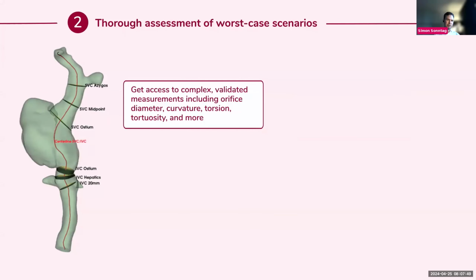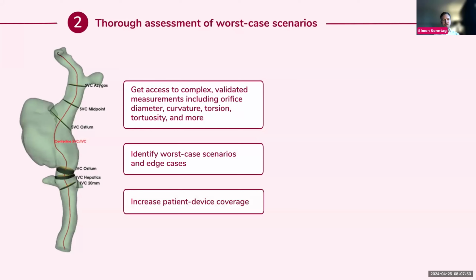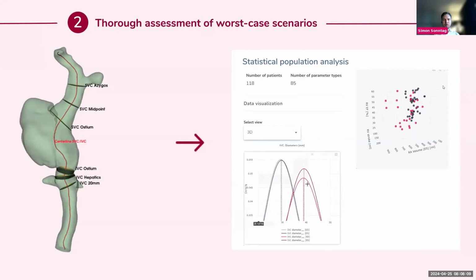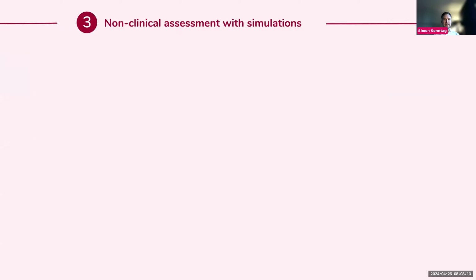The next step, you can then access also the statistical analysis. So as such, I define maybe the worst case assessment. Like here, then a multitude of patients, you can see, you can cluster it in male, female patient, but also in different pathologies, diseases, which are measurements that you perform there or that automatically are performed, to then have these density curves also to assess the statistics of the population.